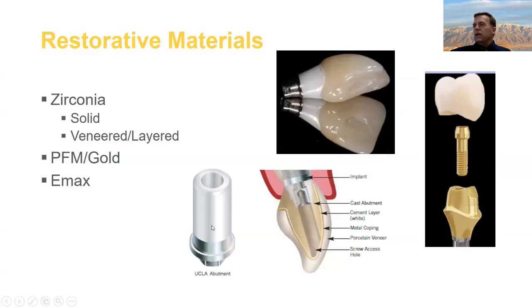Again, they have all the pluses and minuses of a tooth-borne. They're really good for super short situations in the posterior, especially in the mandibular posterior, where you got a lot of load, but you're probably not going to do a lot of those.